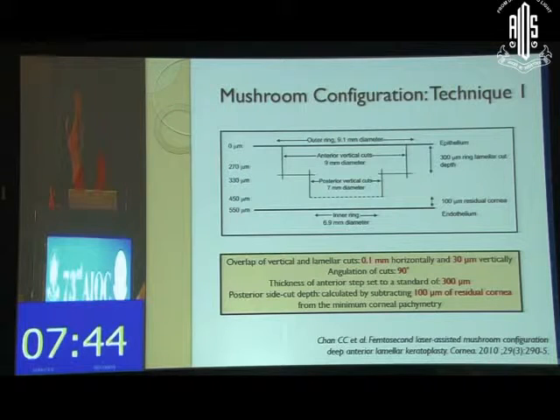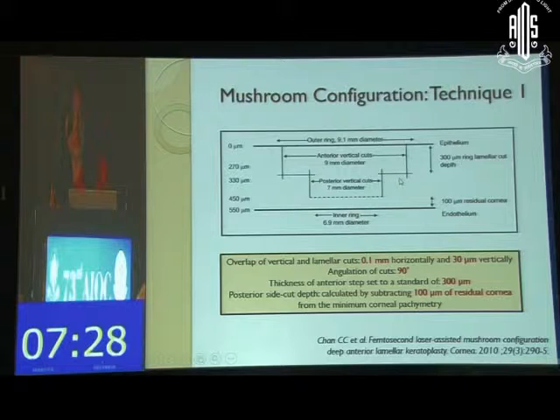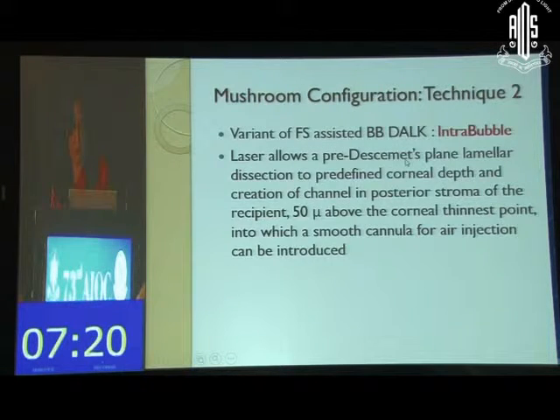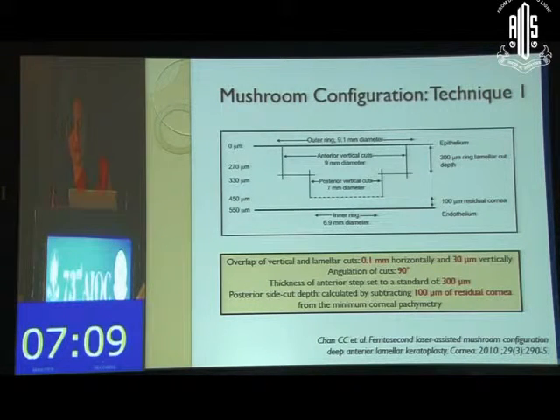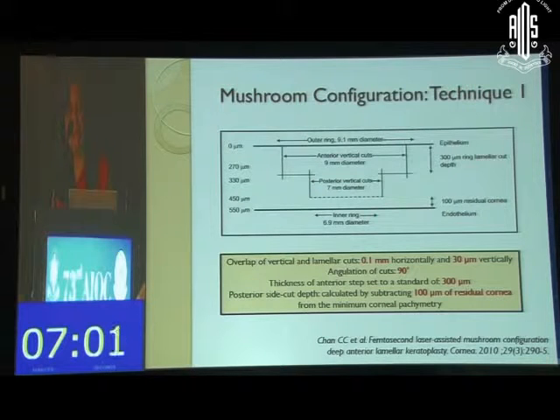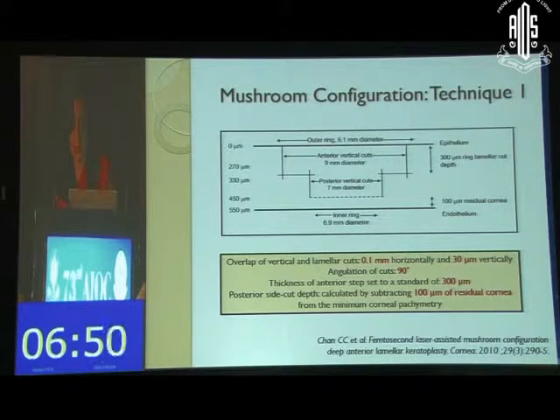The overlap of the vertical and lamellar cuts is 0.1 mm horizontally, the depth is 30 microns vertically, the angulation is 90 degrees, and the thickness of the anterior step is set to 300 microns. The posterior cut is made 100 microns away from the residual cornea based on the minimum corneal pachymetry. It is important to feed the parameters correctly into the machine, and even then you can still have surprises.